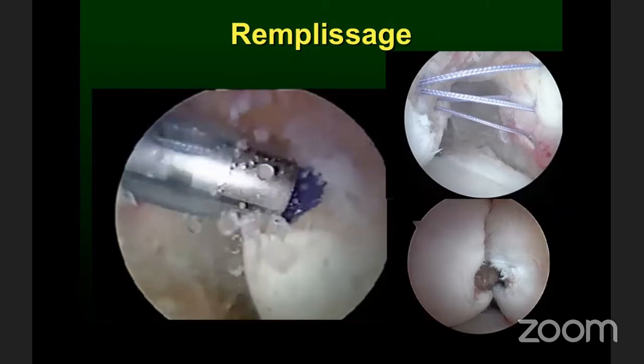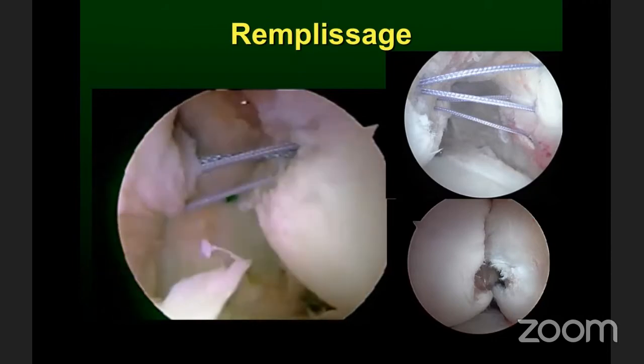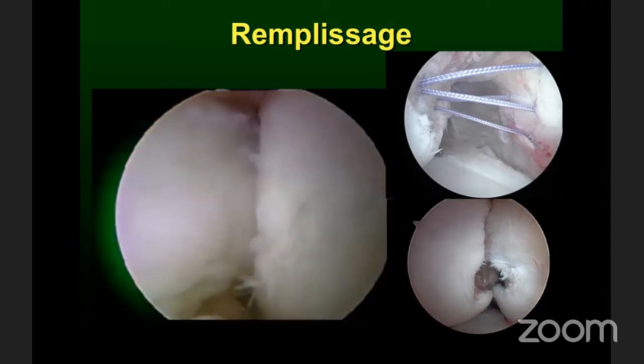You have to place an anchor as close to your cartilage lesion as possible so that you can make it extra-articular. Then you can pass your suture material through the infraspinatus tendon or the muscle to cause the tenodesis. So basically you have to fill that defect with the help of muscle or tendon.